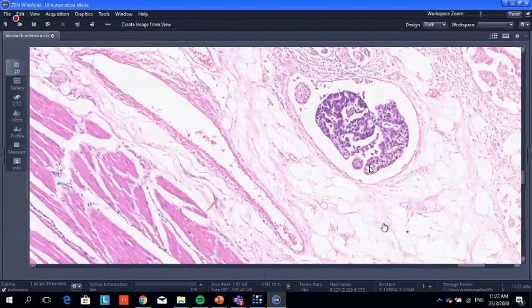Okay, so how to describe this? Question 4.2: look at the micro slide from the specimen. Describe your findings. Identify areas of normal gastric mucosa. We already saw intestinal metaplasia with goblet cells, and adenocarcinoma. This is the tumor emboli, within vessels and lymphatics. Name this condition: gastric adenocarcinoma.